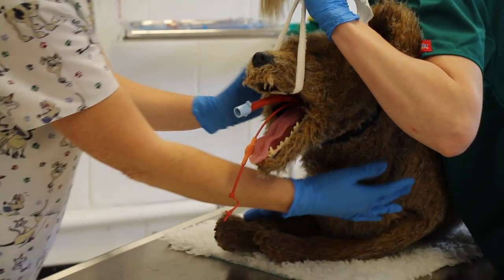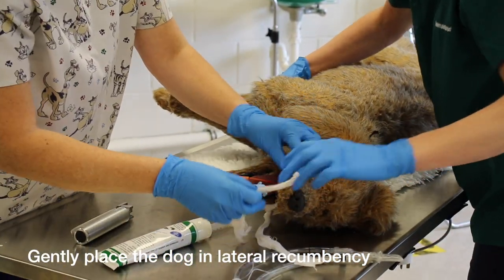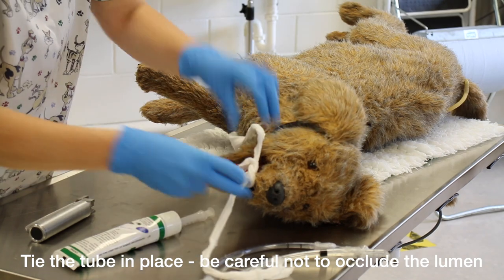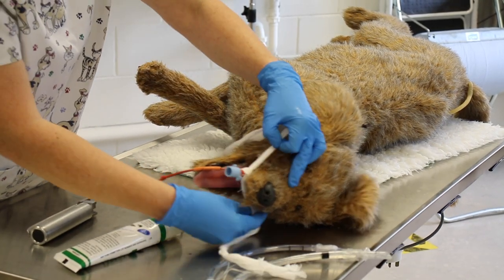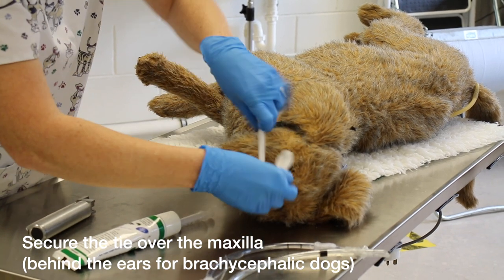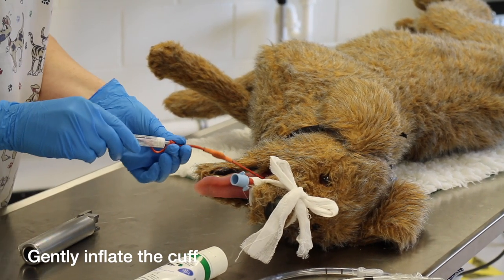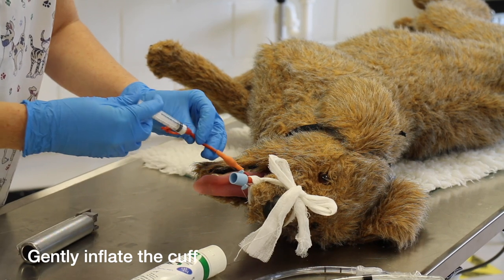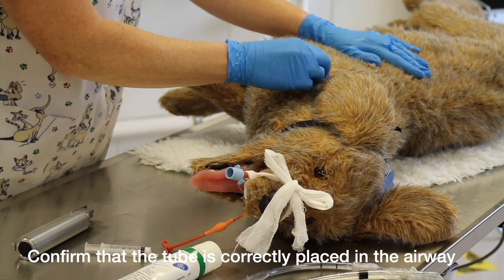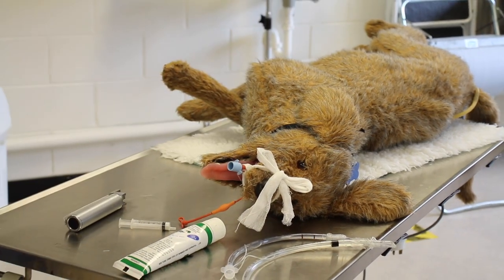The patient goes back into lateral recumbency. We're going to secure that ET tube in place — secure behind the connector, make sure your knot is not going to slip through, and tie it above the nose. Finally, we inflate our cuff. We check for placement, and once we're happy it's in place, we connect our circuit.